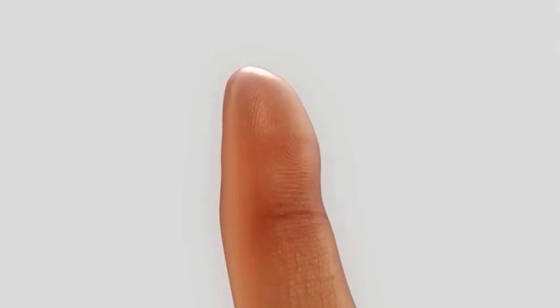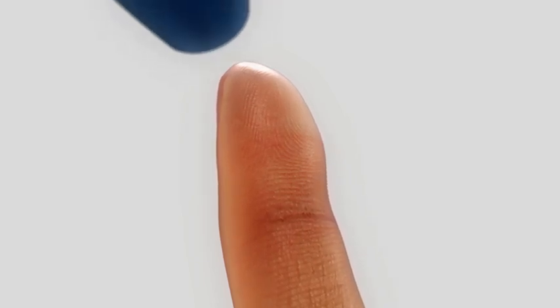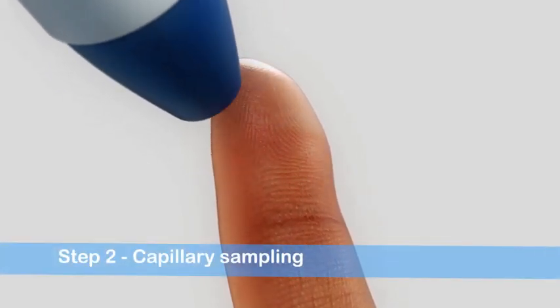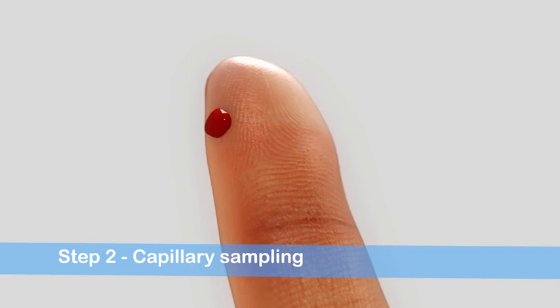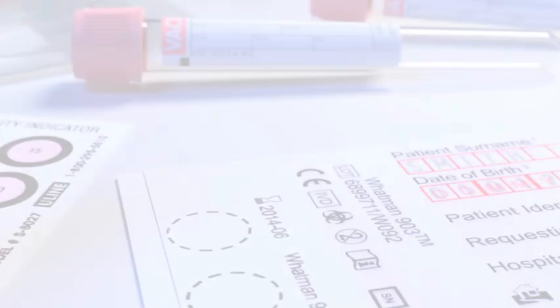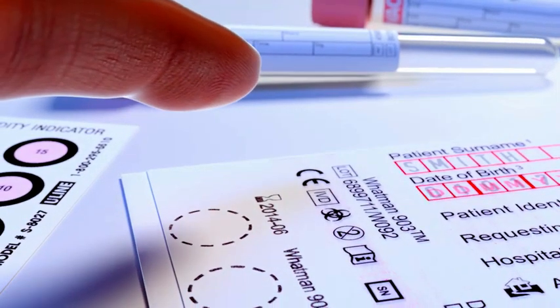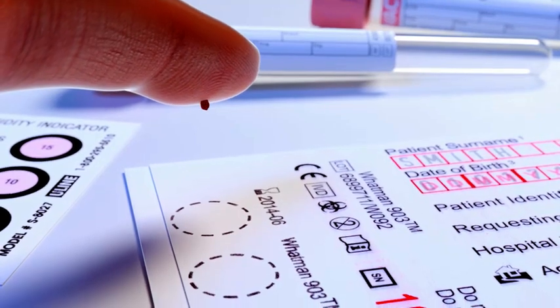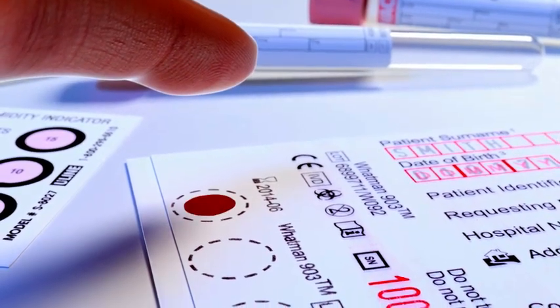In patients over six months, two blood sampling methods are possible and capillary or venous blood can be used. Only four blood drops from each patient are needed. Warm the site of the extraction. Cleanse the site with an alcohol swab. Allow area to air dry.